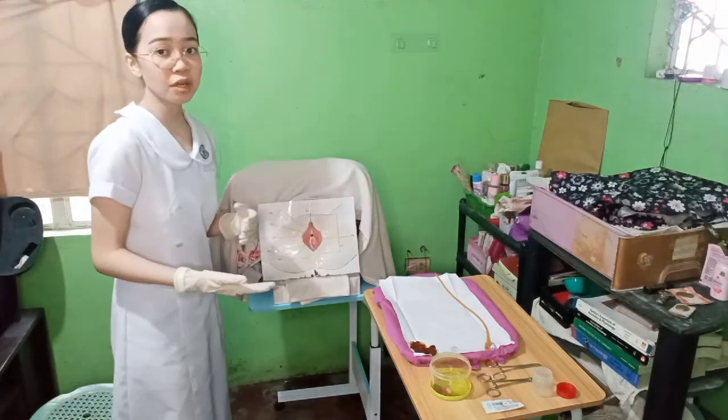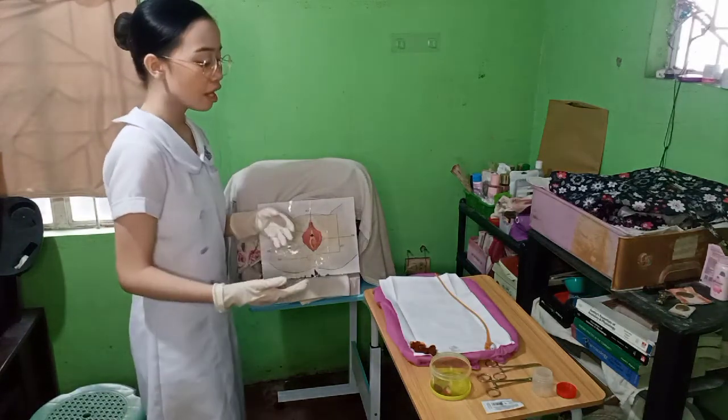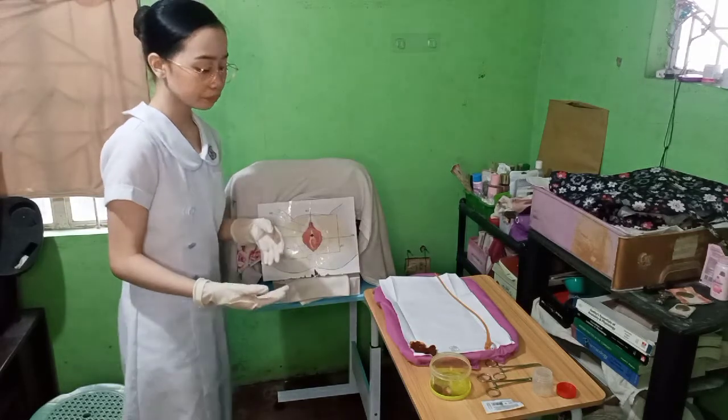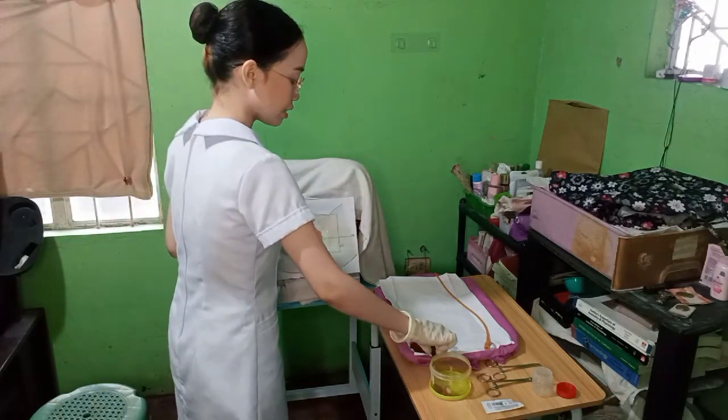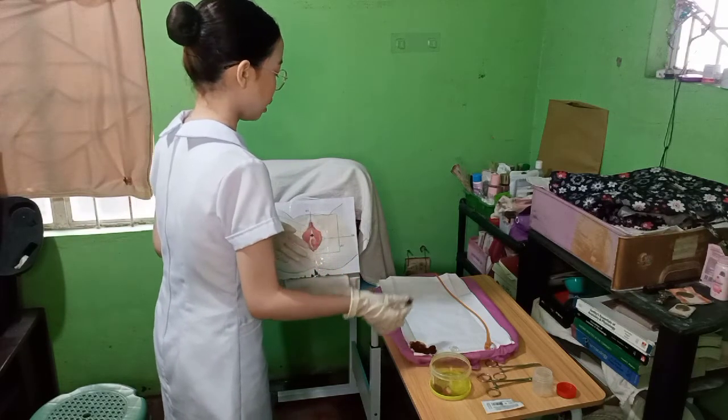So first, clean the mons pubis and the left and right inner thighs of the client by using cotton balls with betadine solution in a single zigzag stroke from proximal to distal perineum.